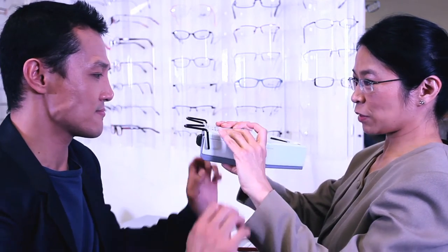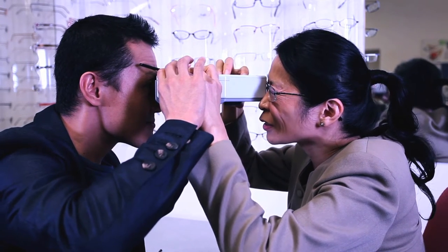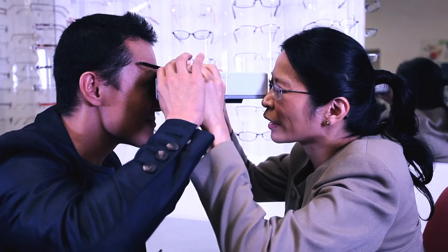I'm going to take a measurement for your new lenses, so just hold this up to your eyes like it's a pair of binoculars and look straight in the middle of the green circle. The black line should pass through the very center of the reflex on the client's cornea. The dispenser then flicks the occluder lever across to measure the other eye — ensure to check both eyes for confirmation.